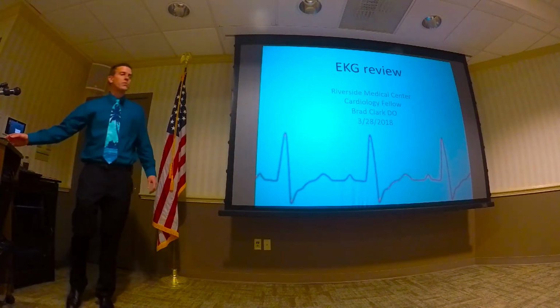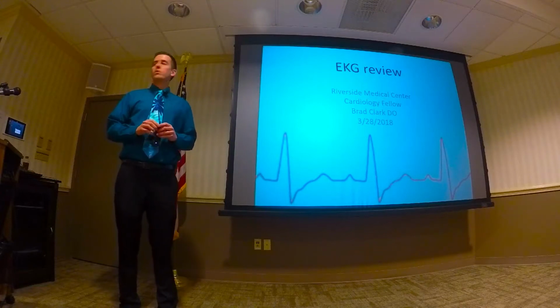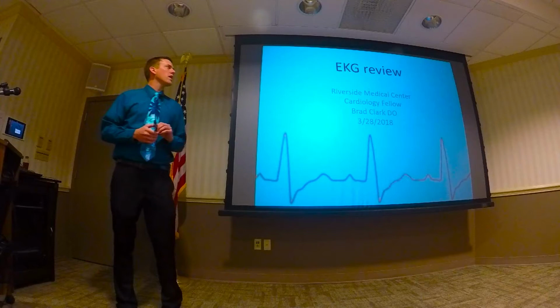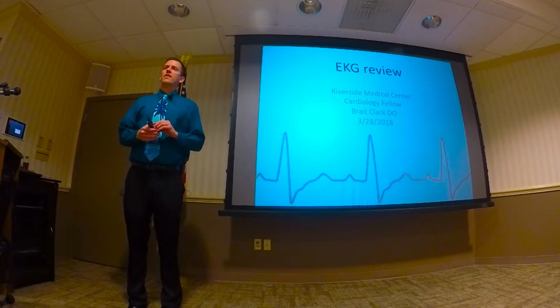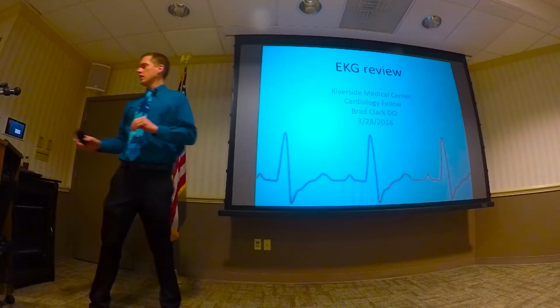And I'm Dr. Clark. I'm one of the cardiology fellows here at Riverside. And today we are going to review some EKGs. I think the goal out of this is that you guys improve your skills as far as rhythm recognition and then recognizing some of the emergent things that you need to address quickly.